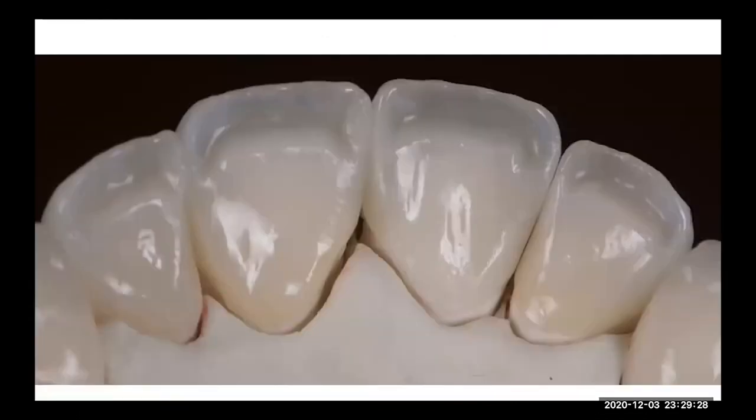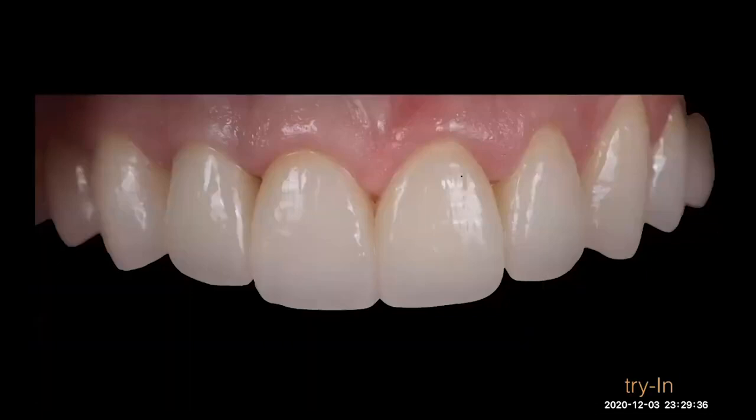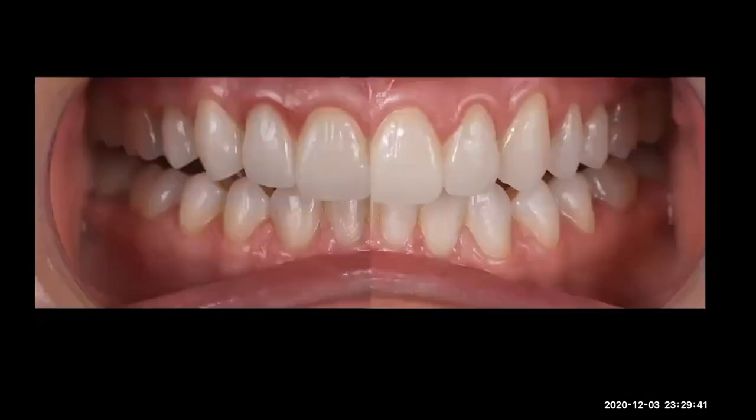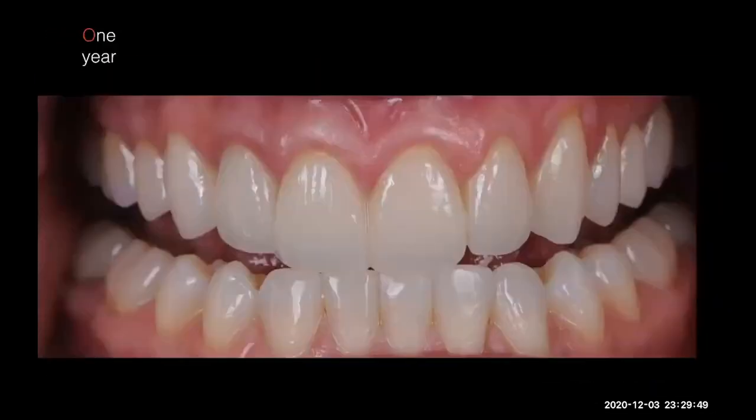You see, we create the concavity. We create our buccal anatomy. This is the day of the try-in. This is a month of follow-up, 3 months of follow-up, 6 months of follow-up, 1 year of follow-up. But you see, everything is using the same technique, the same concept. Do the wax press and then fill the spaces, the lingual spaces, with some stain and then some ceramic.